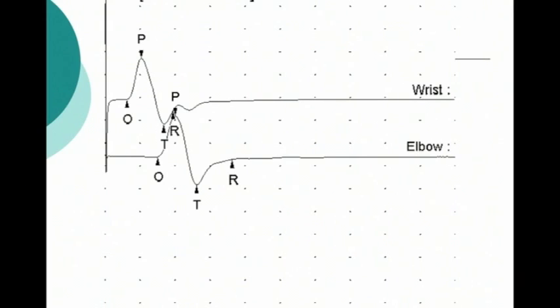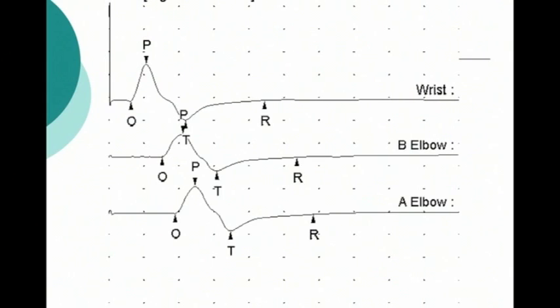In this case, we're going up to the upper extremity. You see the median nerve, median motor. Again, if you recall, the median nerve is a nerve that we stimulate in two places, the ulnar nerve in three places. You see very nice responses, and you see that the cursors were placed properly. The responses look the same, slightly lower amplitude at the elbow. Nothing wrong with that. And it's a great motor response.